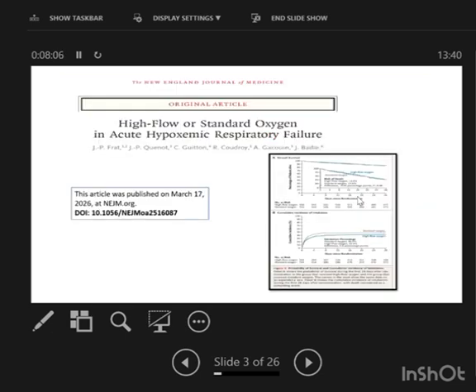So this I wanted to include, this was published yesterday. Now they are struggling actually. This study is very good. We are going more towards non-invasive. So doing invasive ventilation, if we can avoid, the first rule is avoid invasive ventilation. That is what we are moving towards. The second rule is, if you are invasively ventilating, use low tidal volume. Madam has already told you. So we are trying to be more on a physiological basis.